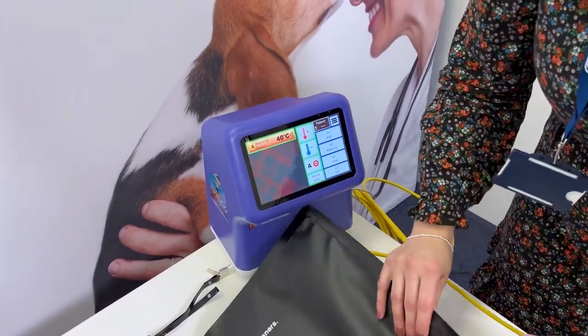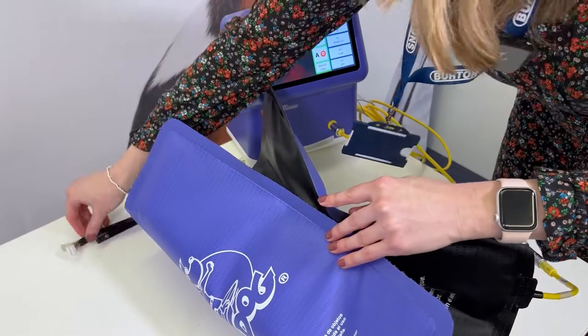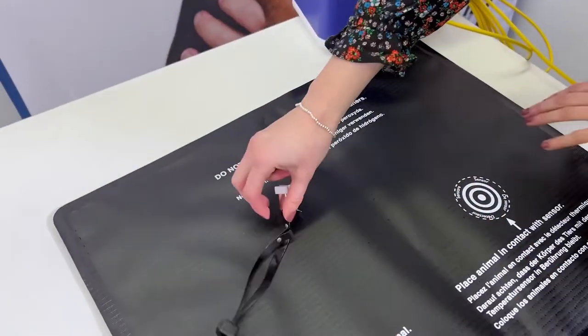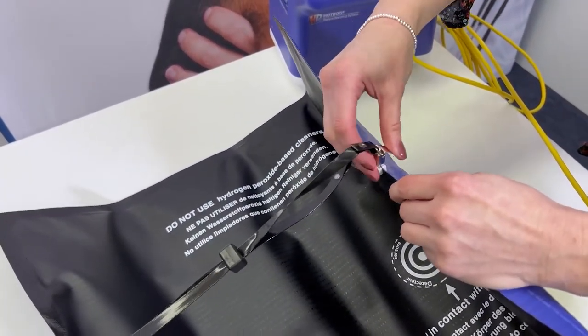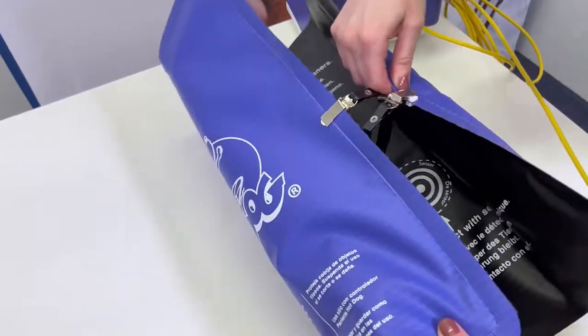When you fold up the hot dog blanket with your patient in the middle, you can secure it with the clips by clipping it over, pulling another one, clipping it over again, and securing it around the patient. You can fold them all the way up like that.